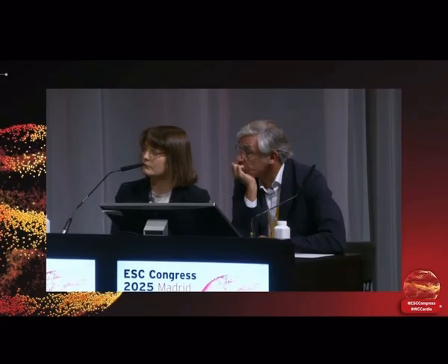And actually, without using anything, we can already combine 3D CT and 3D map. It's possible in all 3D mapping system. But just important issue, you have to explain, we need a thickness of epicardial fat pad in 3D CT image. But now I am usually working with some companies about that to get this data. But of course, your radiologist can learn, and you can do that without paying anything.